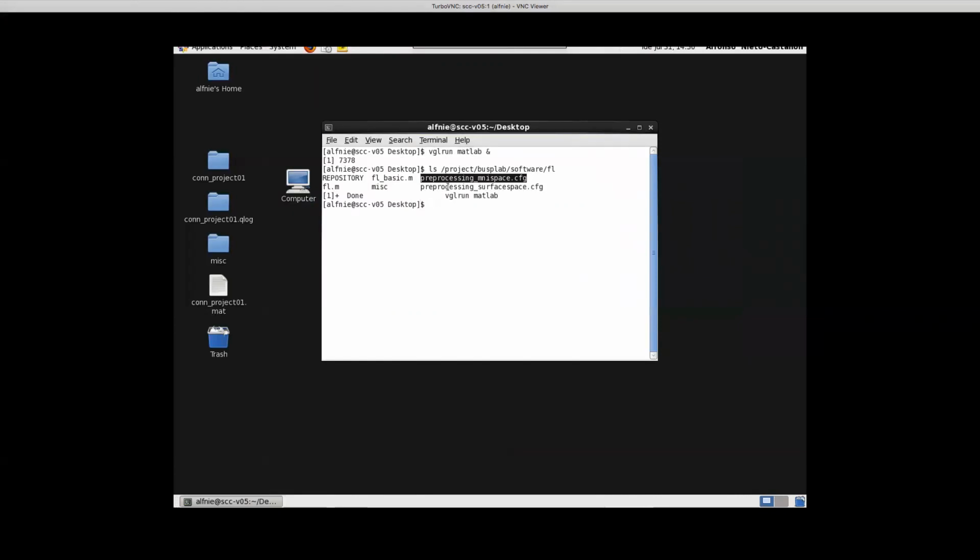Can I make a suggestion, Alfonso? Yes, please, go ahead. The preprocessing surface space is not orthogonal to preprocessing MNI space. So would it be possible to change preprocessing MNI space so that it's like preprocessing volume MNI space, or preprocessing volume direct, or preprocessing volume indirect? Oh, I see what you mean. So specify directly in the name that MNI is actually a volumetric pipeline, as opposed to surface.